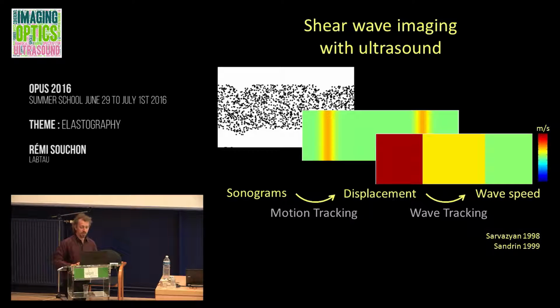So these are major differences between the 2 techniques, and this technique has another advantage. You see, we're not hindered by the boundary condition. In this example, the 3 layers are vertical. That was the scenario that was causing problems for the strain image. You see, it's not creating any problem for the shear wave technique. We can retrieve the 3 regions without any artifact.